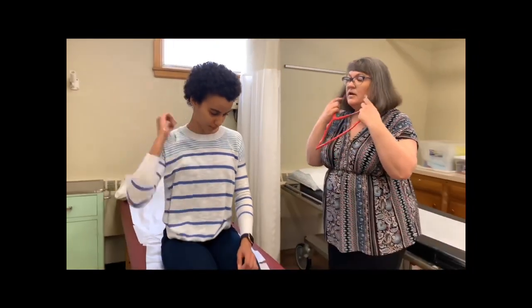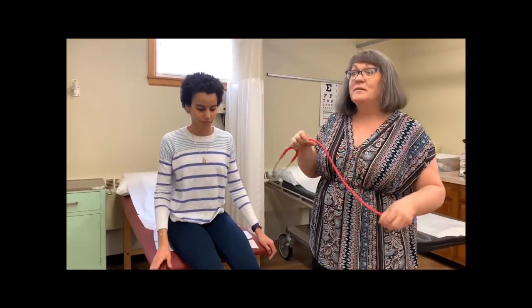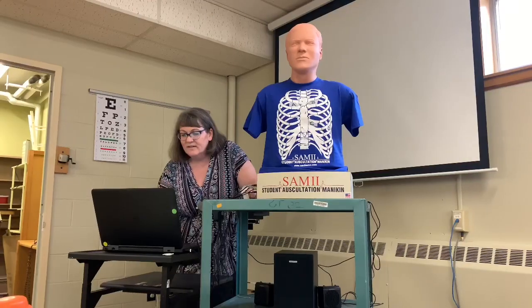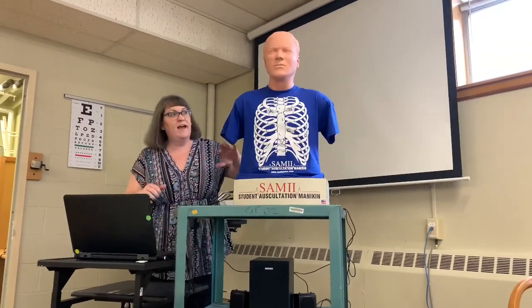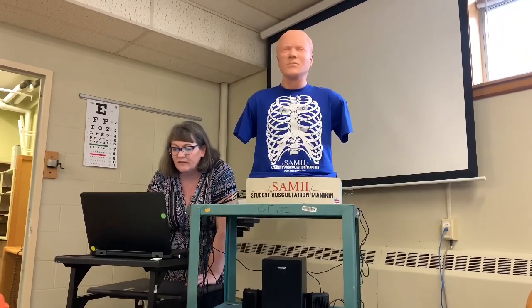Excellent. Good. Okay, so now we're going to move over to the simulation, and we'll play some adventitious sounds so you guys can identify those. Okay, so now we have our simulation torso, okay? And we're going to play some lung sounds for you guys to be able to identify. So can anybody tell me what this first sound is?